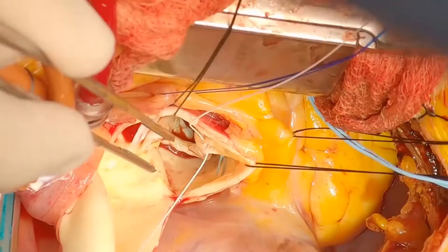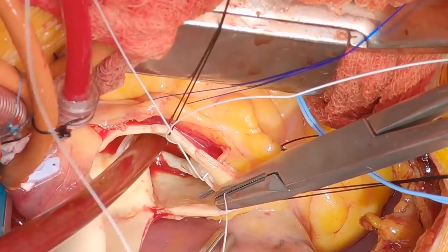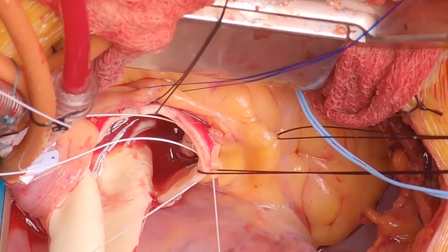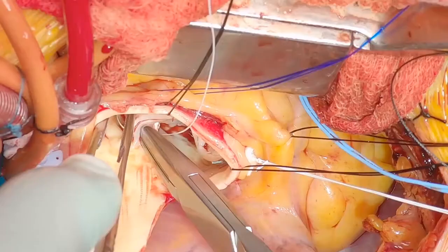I used to use 5-O ethibond for this, but stopped many years ago because I had a patient where it tore through. The Gore-Tex PTFE has a bit more springiness to it and is a bit thicker. Because it's not a multifilament suture, it's less likely to saw through the tissue. We put a pledget on this to anchor it so it doesn't tear through the aorta. Without that, particularly if sutures are close together, you may have bleeding from this figure-of-8 suture. An external pledget helps, and I put a clip on so it doesn't unravel — one of the problems with Gore-Tex.